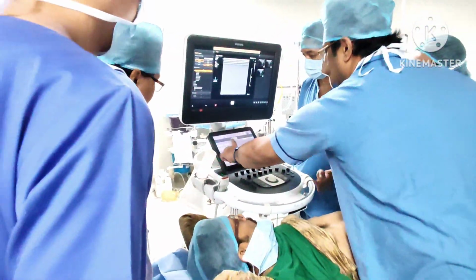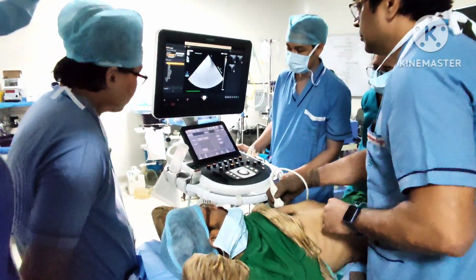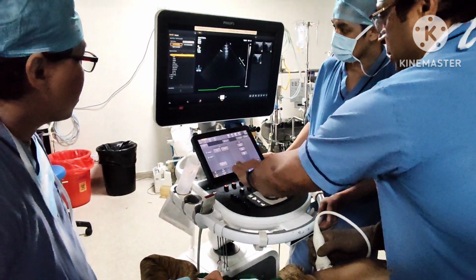You can adjust accordingly, right? You place it over here.